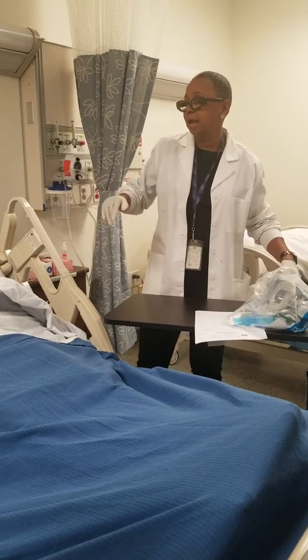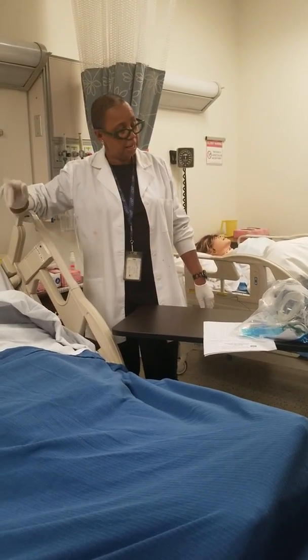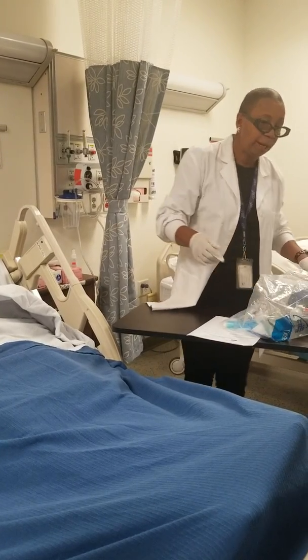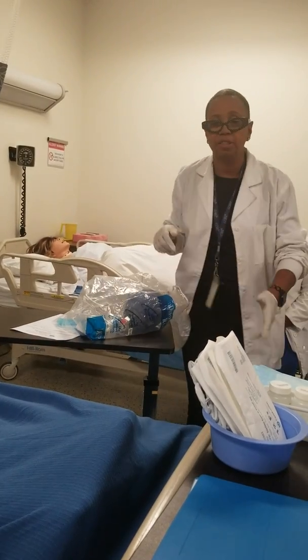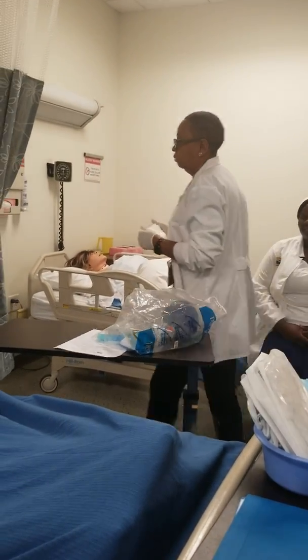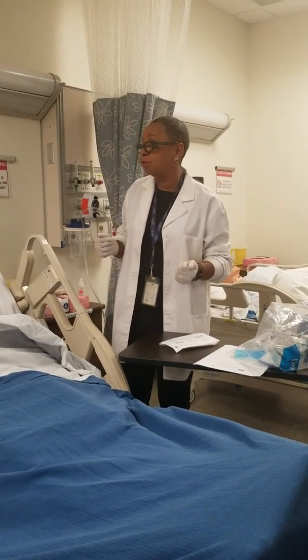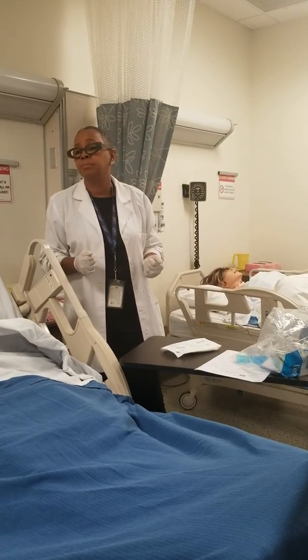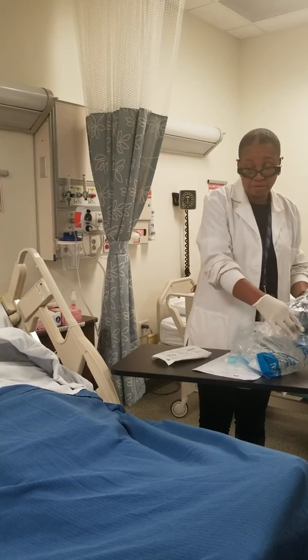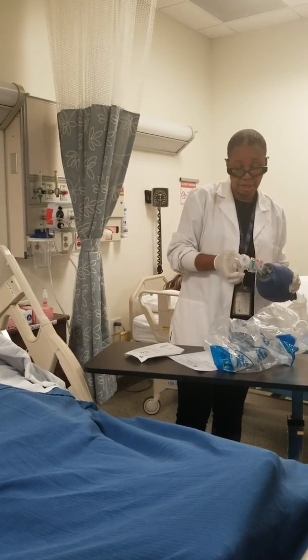At this time, like I said, I can make the decision to hyperoxygenate him if he needs it, just for the sake of it. Let me get the suction. So I need a suction catheter, right? How long would you hyperoxygenate them before you get started? Just for a couple of seconds. Did they give you a time? No more than what I think he needs. About 10 seconds is all I need. Here's the deal, actually, it does say 30 seconds. 30 seconds to hyperoxygenate him, okay.